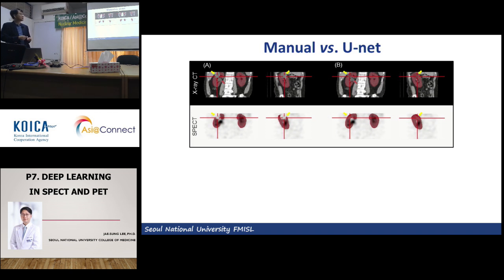I think this is because sometimes it is hard to distinguish a cyst or tumor from the kidney parenchyma in the non-contrast enhanced CT. The deep learning couldn't do it, but I think the human referred to the contrast enhanced CT, so they may know that this is the tumor or the cyst with the help of that addition.